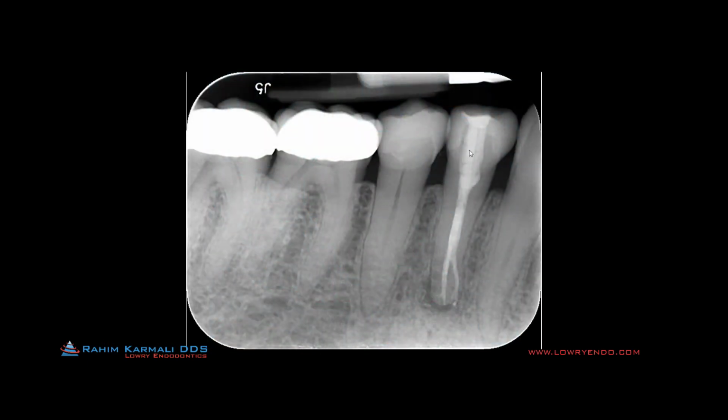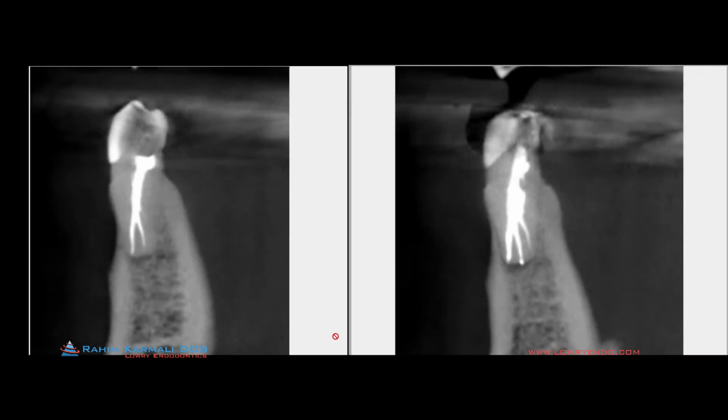Here's the fiber post we placed in the root to prevent this weakened area from breaking, from cervical snap-off. Two-dimensionally, the root canal fill looks pretty good, but we don't really have a sense of where that third branch is. So we acquired a post-op CT to make sure that we've got the anatomy the way we thought we did clinically. So this is a pre-op and a post-op comparative CT. On the pre-op, you can see the two main branches, but the third branch, which was left untreated, you can see a little hint of it here. On the post-op scan, you can see that we got a good dense fill on all three branches.